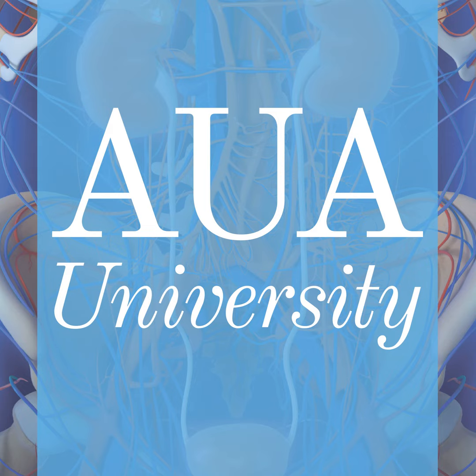For biochemical recurrence after radical prostatectomy, the EAU guidelines recommend a PSMA PET if the PSA is greater than 0.2 and if the results will influence treatment decisions. And that's key throughout the EAU guidelines. And we'll go into the risk stratification system briefly afterward.